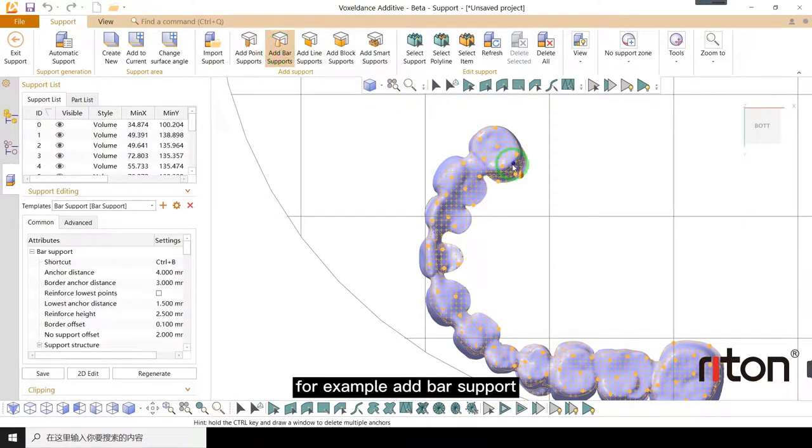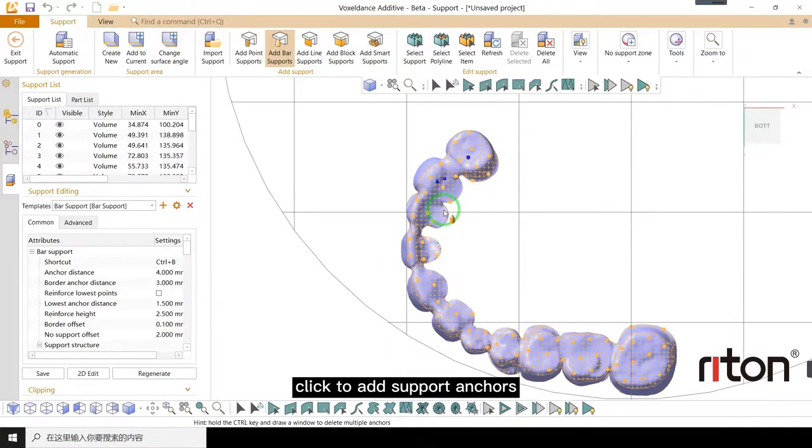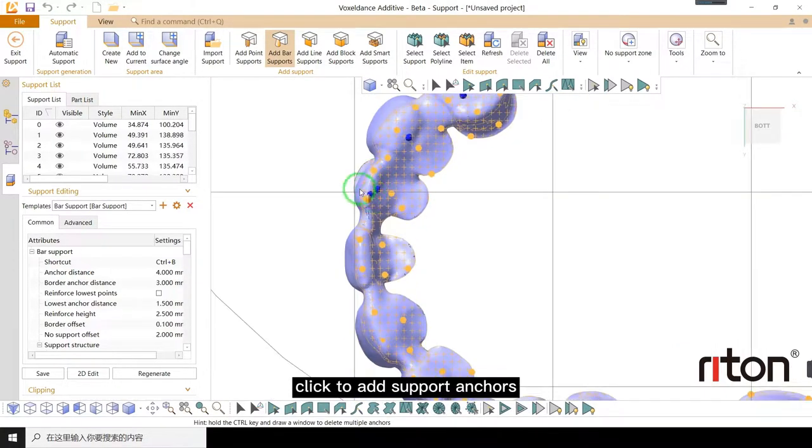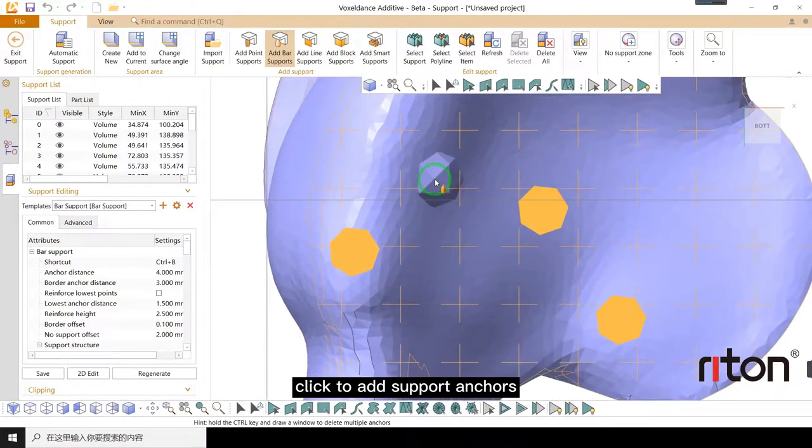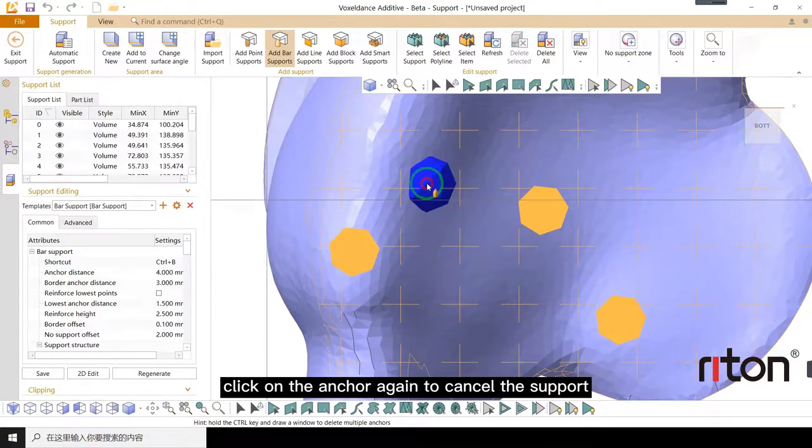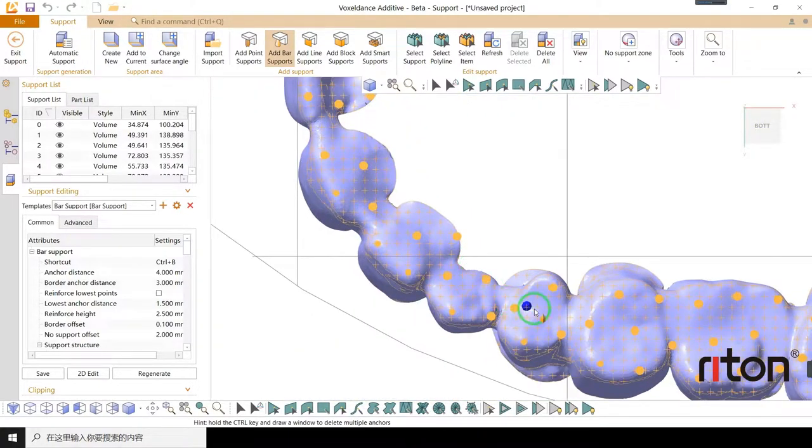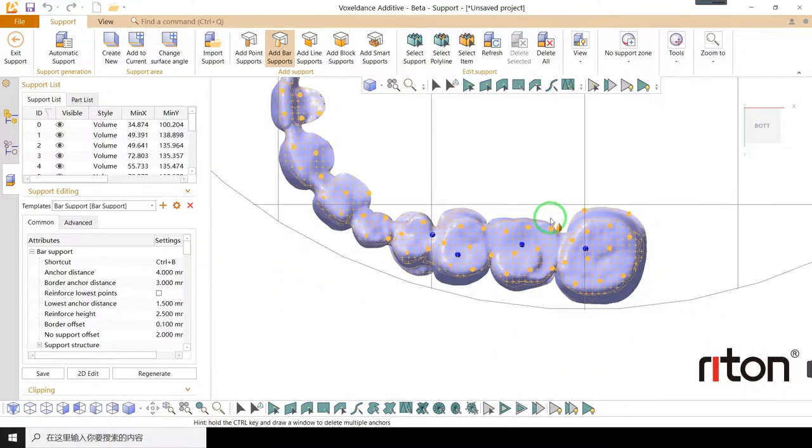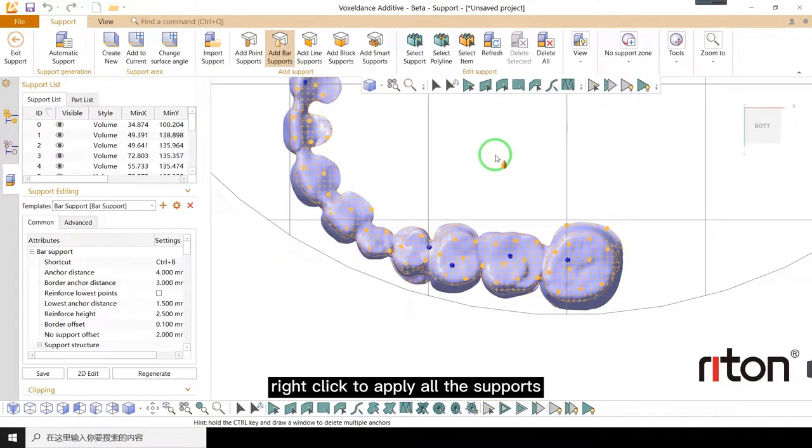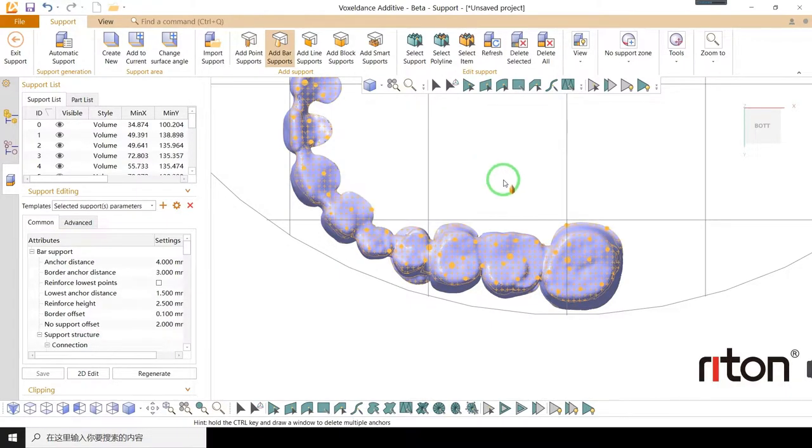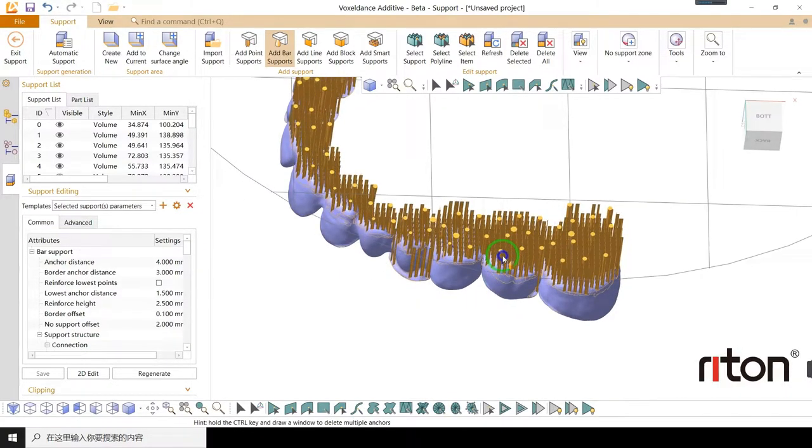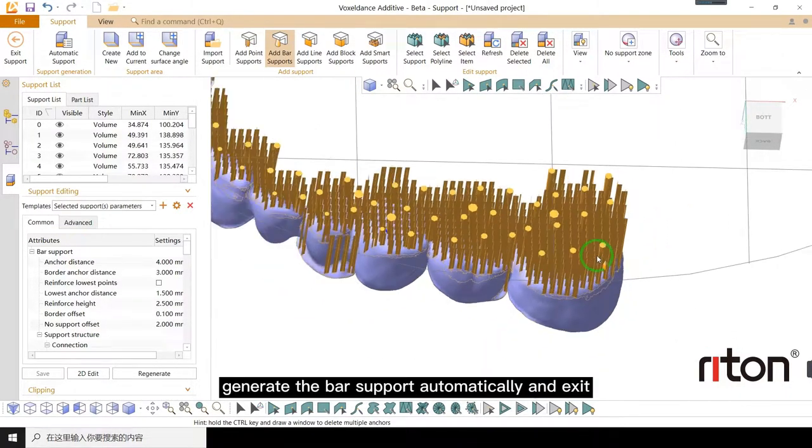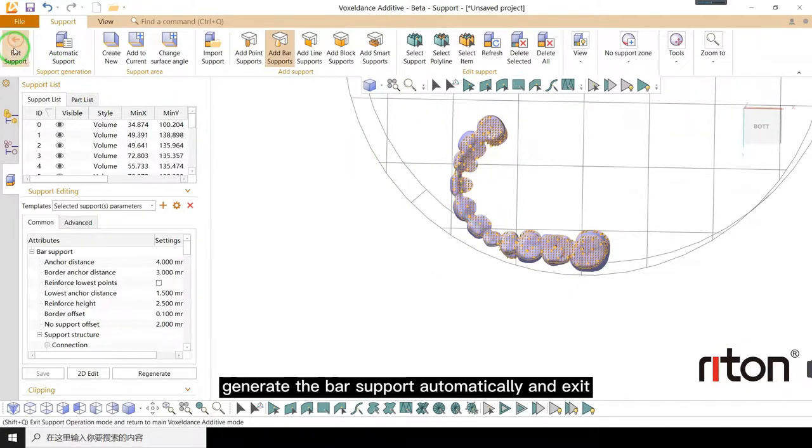Select, click to add support anchors. Click on the anchor again to cancel the support. Right click to apply all the supports. Generate the bar support automatically and exit.